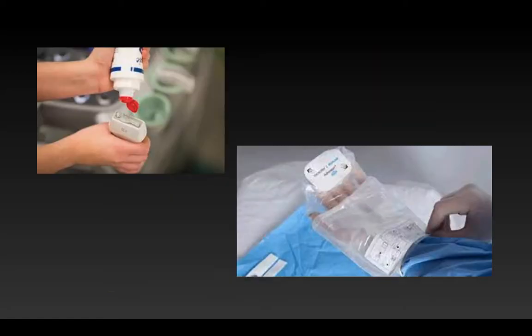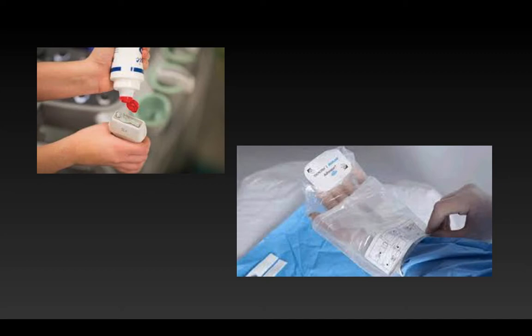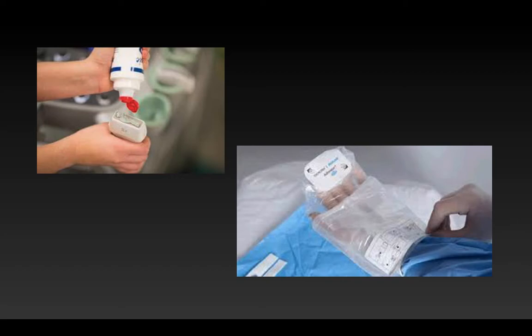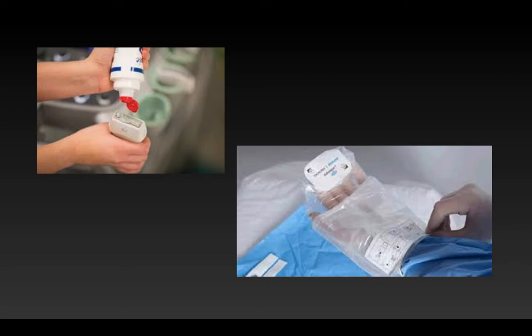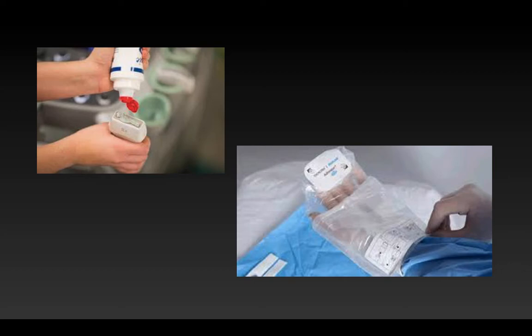Starting, you'll want to prep your linear probe. This means covering the footprint with a significant amount of gel that will go underneath your sterile probe cover. This is easier to do with an assistant that can hand you the probe into the sterile probe cover, but I encourage you to set up so that it can be done independently. Cover the probe with the adequate amount of gel and then place it in a location that you can easily reach and grab.